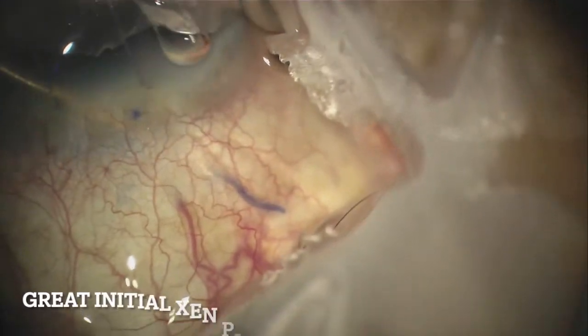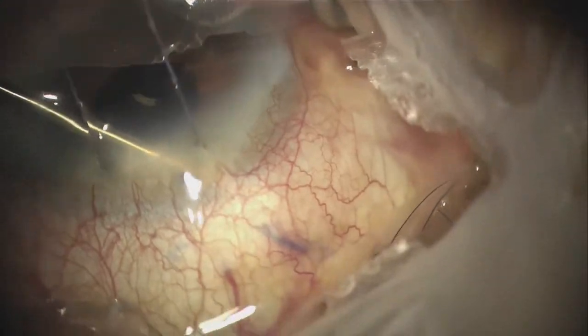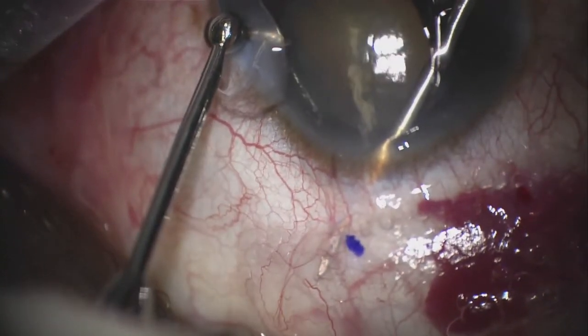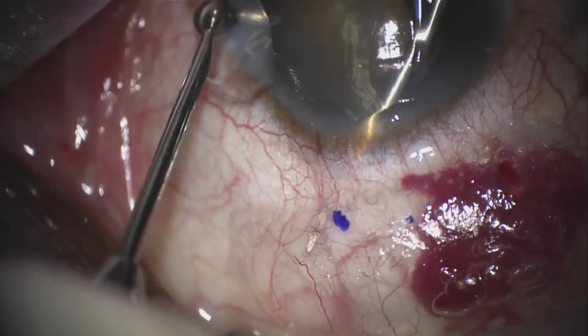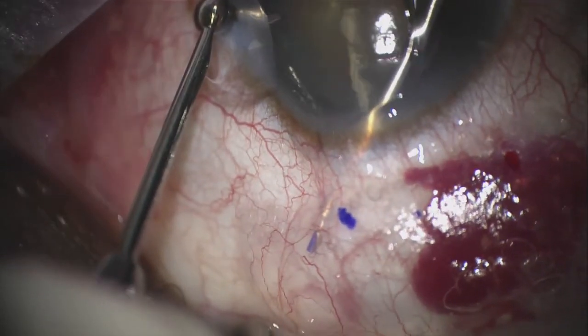Another common mistake seen in the Xen procedure is rushing through the implantation with the Xen injector. This can lead to the misplacement or flick of the Xen, requiring a reload and redo. To avoid this, after placement of the tip through the sclera and under conjunctiva, it's best to really take a short Xen moment. Take a deep breath.